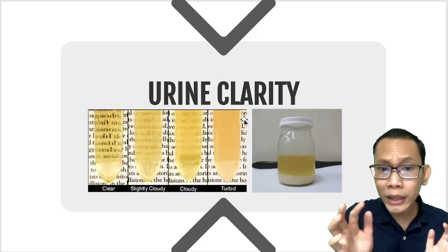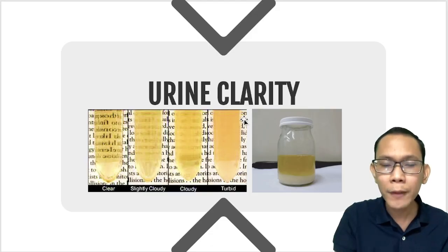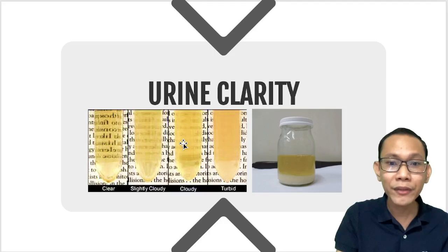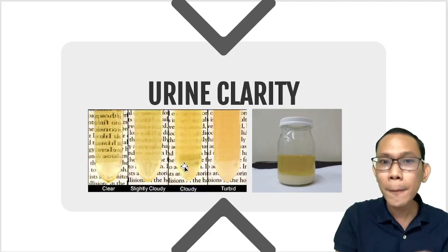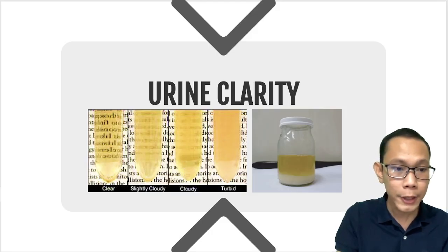But of course, at your level, you're somehow not sure na, is it really slightly cloudy or turbid? Then, this is the best way for us to identify these terminologies para at least ma-make sure nyo na tama talaga yung ating urine clarity. Okay?